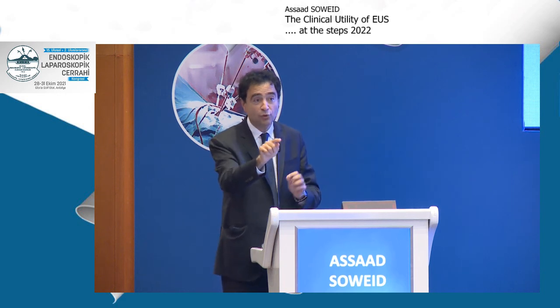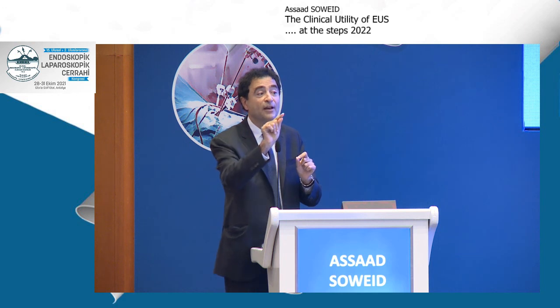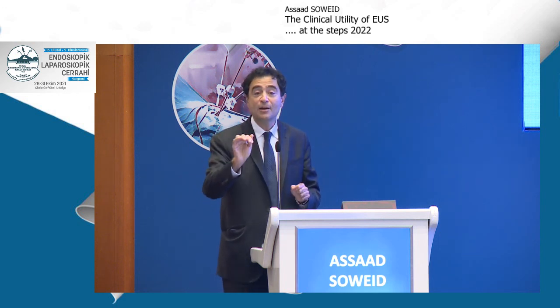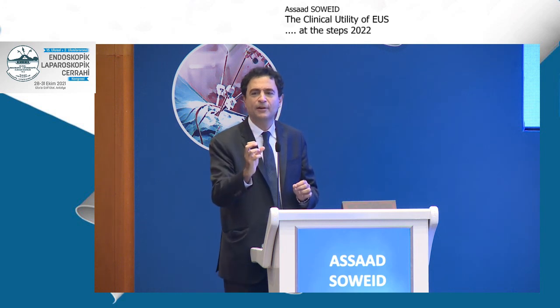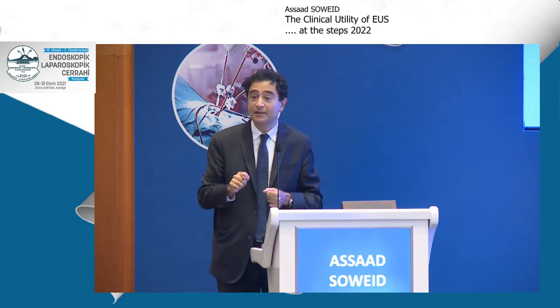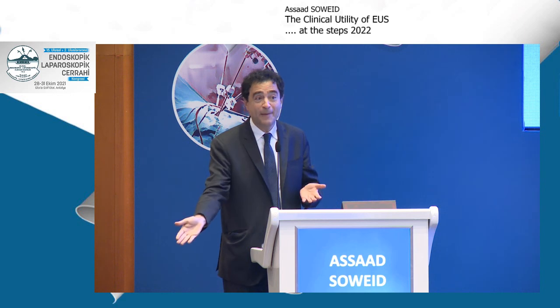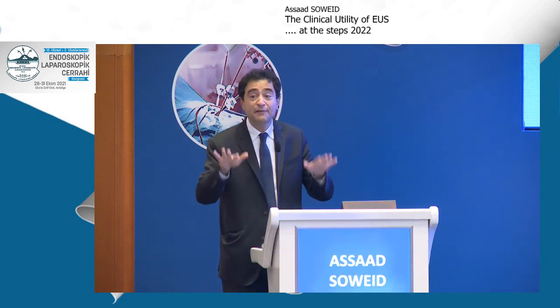But I would take your question very seriously, that there is still a risk of seeding, specifically if you do it in the body and tail, so you have to weigh the risk and benefit. For example, a young man with a solid lesion in the tail of the pancreas that looks malignant by elastography, by EUS, I do not biopsy, for the reasons that Dr. Hassan said. Because even if there is a small chance of seeding, this is a young man. So I would send for surgery immediately. So you have to individualize.